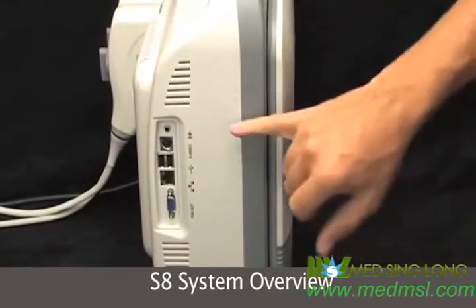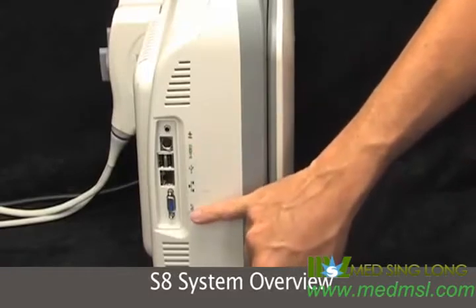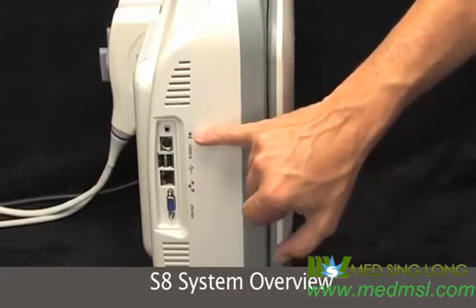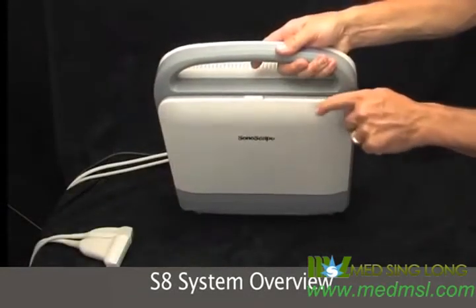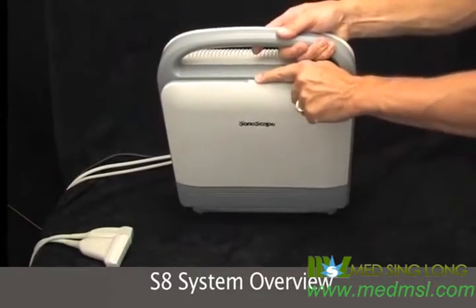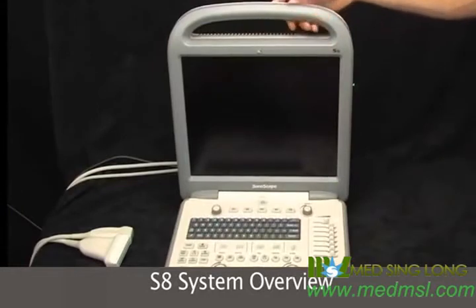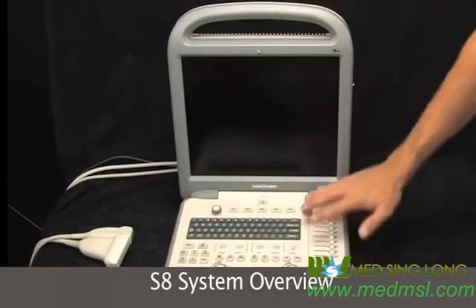On the side we have our S-Video, VGA out, networking and USB ports, and audio out. So here's the latch — just pull it aside and then you can open it right up. And we have a flat panel monitor and the keyboard.